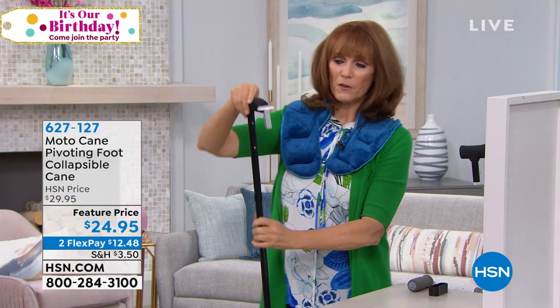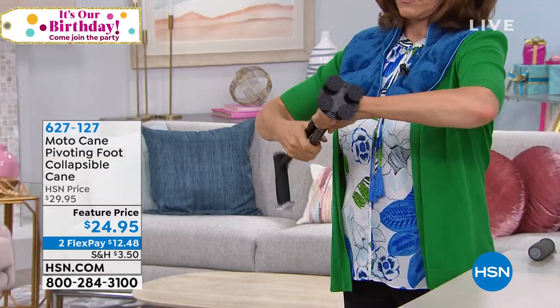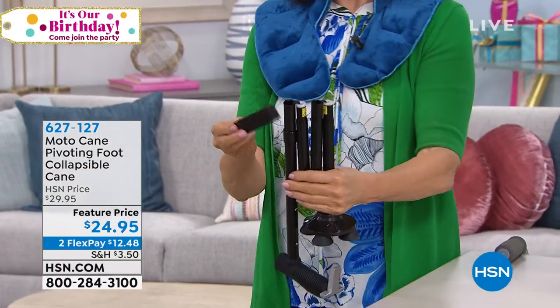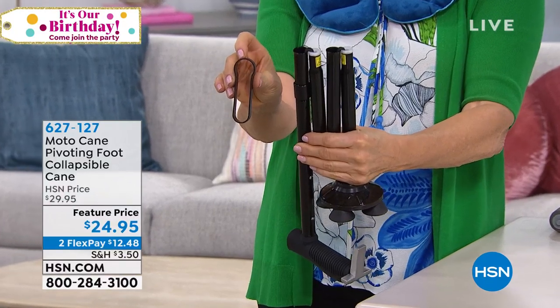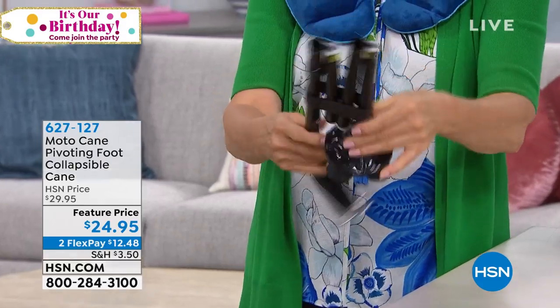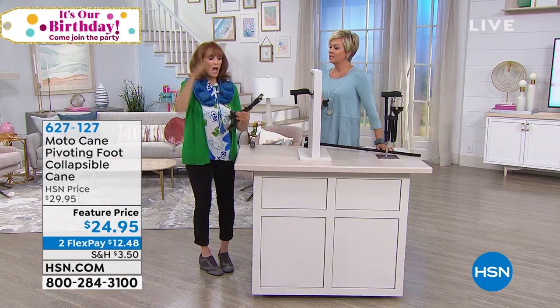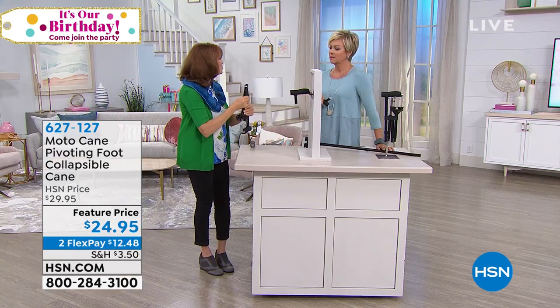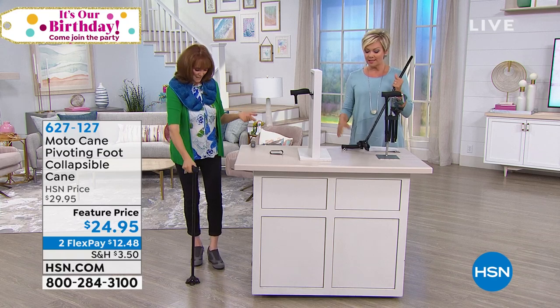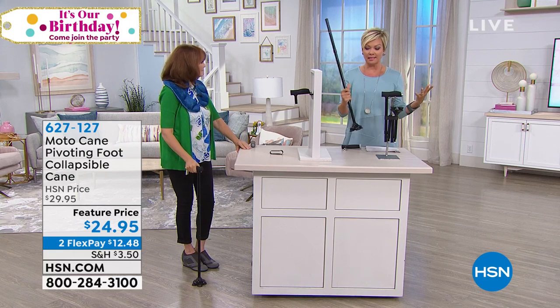Let me show you how this comes apart. You take it down, take it down, take it down. It does come with a cover that holds it together. One side is bigger than the other because of a little bump, and the cover simply goes right over it and keeps it stable. So if I'm going on the airplane, putting it in the overhead bin, or in the back of my car — I can do that. Most canes are cumbersome, but this is so compact.